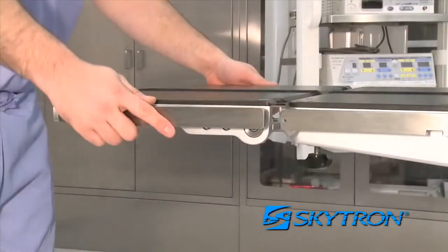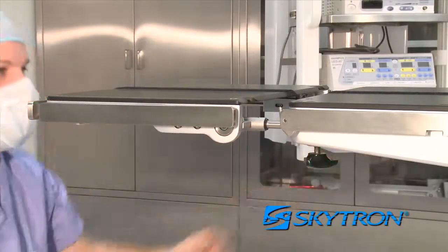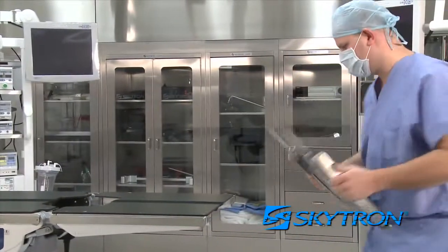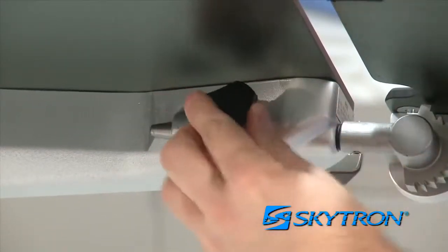For tall surgical patients, the head section can be loosened, pulled back up to 3 inches, and re-tightened for additional table length. It can also be removed completely and inserted into the leg section to provide additional leg support. Be sure it is secure by tightening the knobs below the leg section.